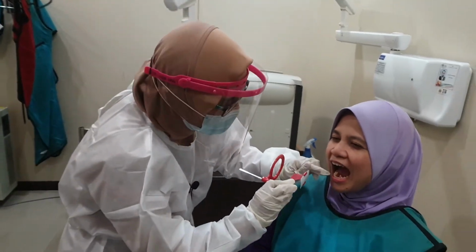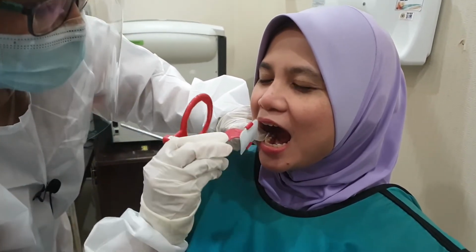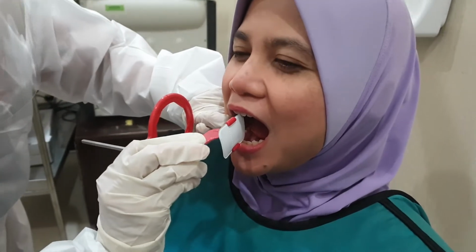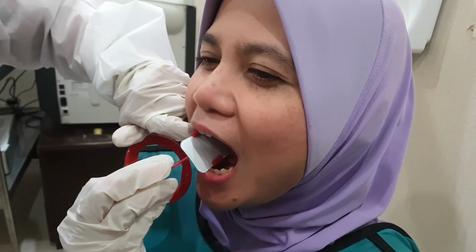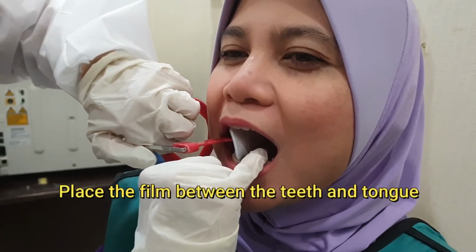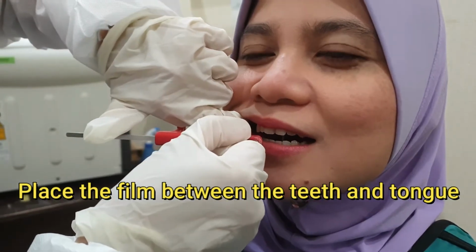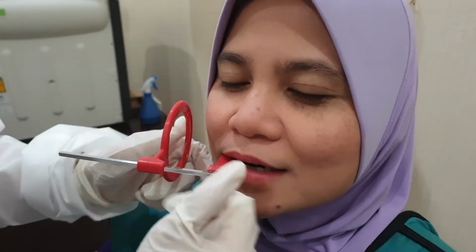Okay, buka luas. Right. And then gently, okay, if you go straight away like this, usually it's quite difficult for the patient. What I normally do, I'll do it like this first, all right, and gently slide it and place the film between the teeth and the tongue, all right, and ask the patient to gently bite on the bite block. Make sure the patient's teeth are in close contact.